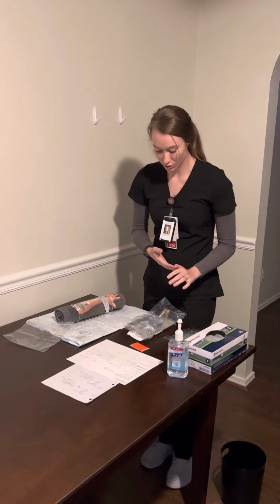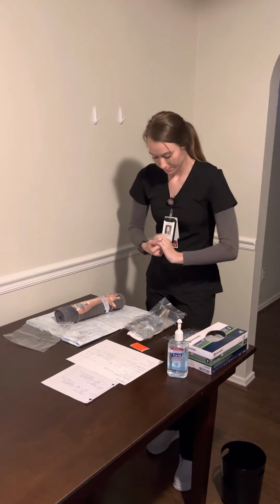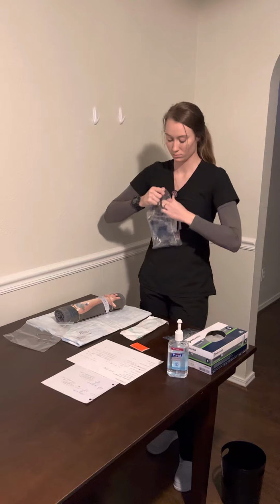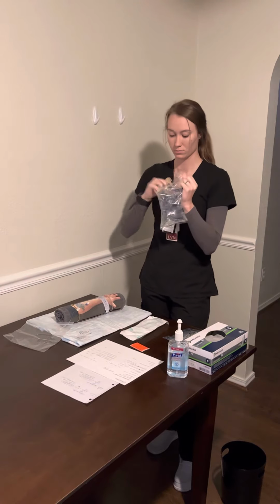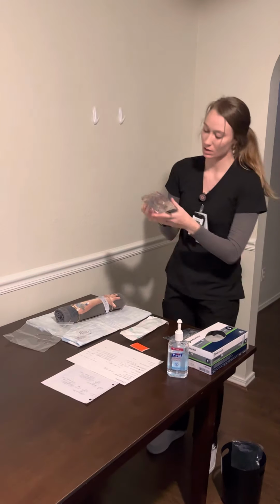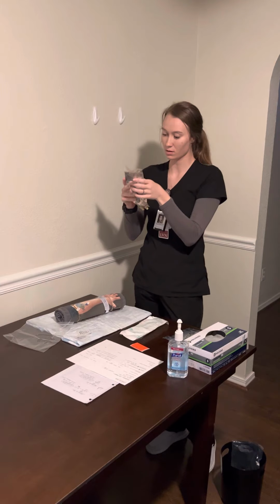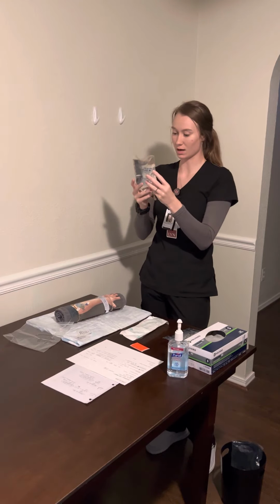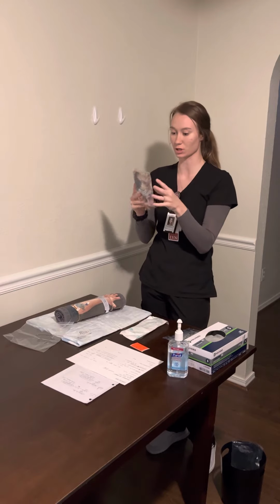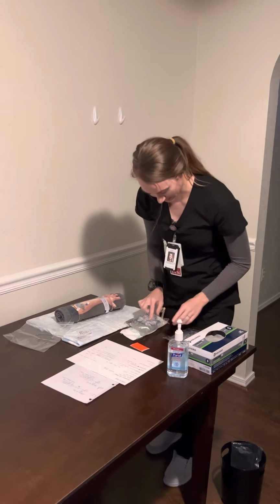So I'm going to inspect my medications. My sodium chloride has an expiration date of 5/27, so that is good. It's not expired. I don't see any floaties or particulate in the solution, and the package is intact. That was my second check.